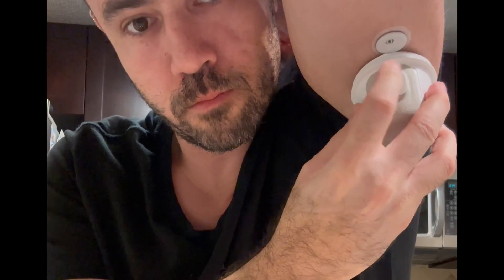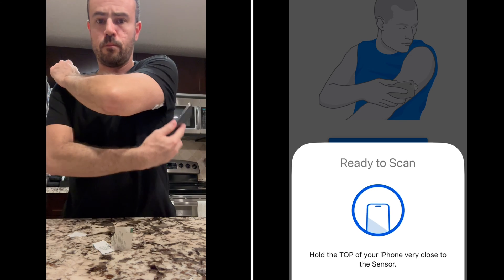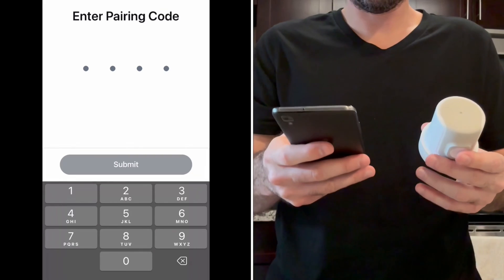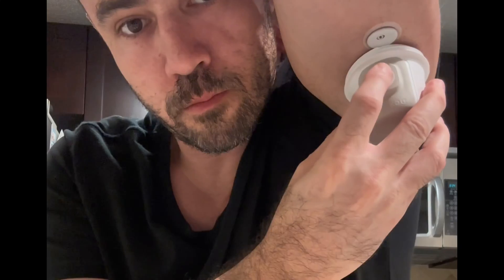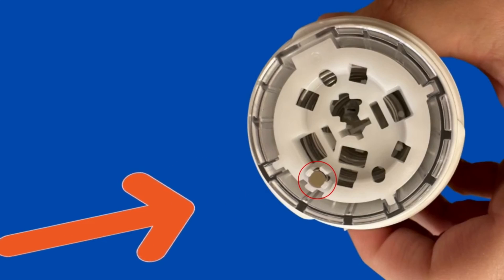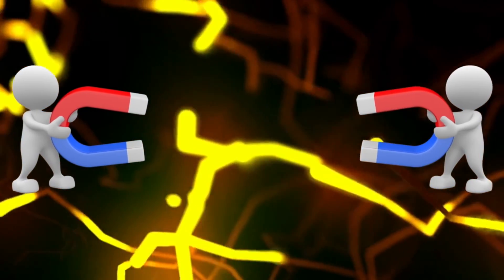The Dexcom G7 has a similar application process — unscrew the top, clean the arm. The only difference is instead of simply pushing down on the top, it also requires depressing a little white button on the side. This is much easier than the G6 that required a separate transmitter to be applied. Both CGMs have a different way to link the sensor to your reader or phone. The Libre requires a quick scan to activate the sensor, while the Dexcom G7 requires a quick four-digit code. One important upgrade with Dexcom is that the CGM automatically starts its warm-up process once placed on the arm, due to magnets inside the sensor and applicator that trigger the countdown when separated.